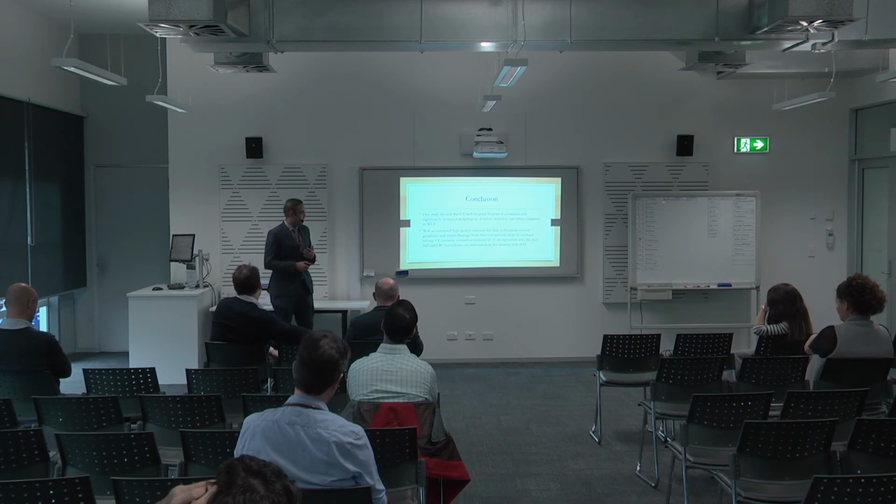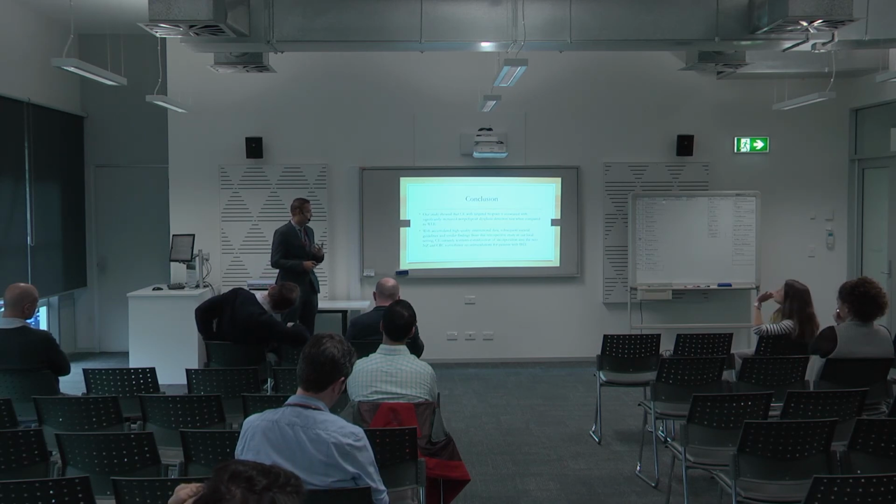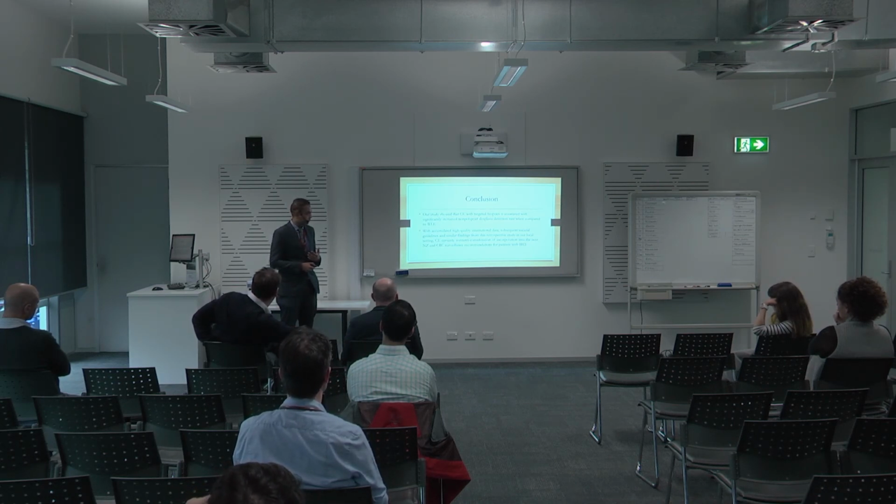So in conclusion, our study shows that with chromoendoscopy, there's a significantly higher non-polypoid dysplasia detection rate. And what we suggest is, with this high quality international data available, and now with local data confirming the same, that we should implement these changes in the guidelines for colorectal cancer surveillance in IBD patients in New Zealand as well.